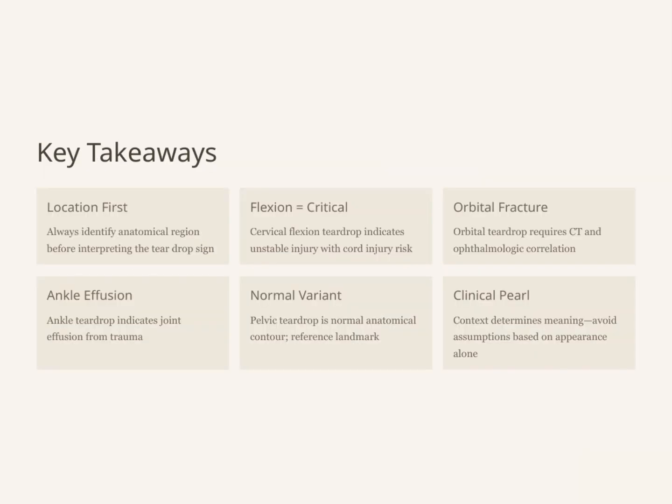Let's go over some key takeaways to keep in mind when interpreting these signs. First and foremost, always identify the anatomical location before jumping to conclusions about the teardrop sign. Understanding where you are looking is crucial because it guides your interpretation accurately.